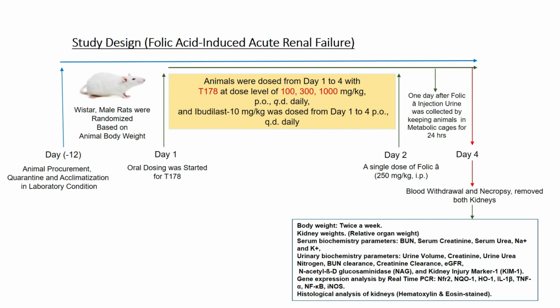We do the induction on day 2, and meanwhile we can start our dosing too. On the same day we can give the dosing or treatment 1 hour after or 1 hour before, and we will continue that. While we are doing this type of experiment, we have to standardize the model first.